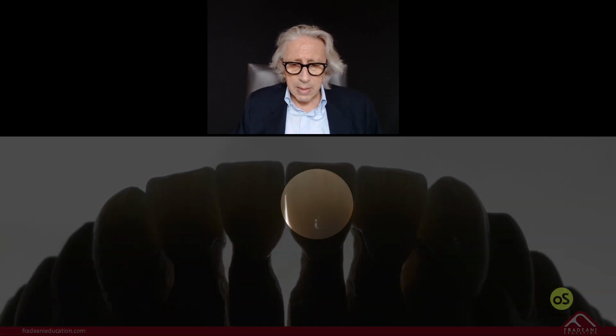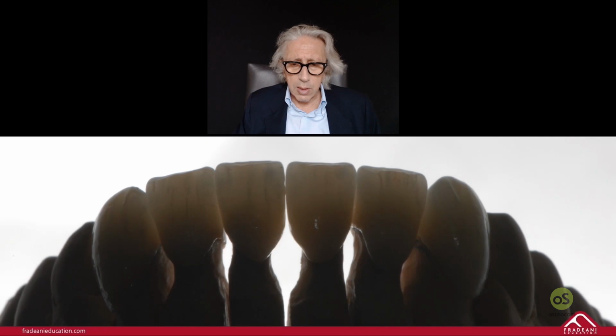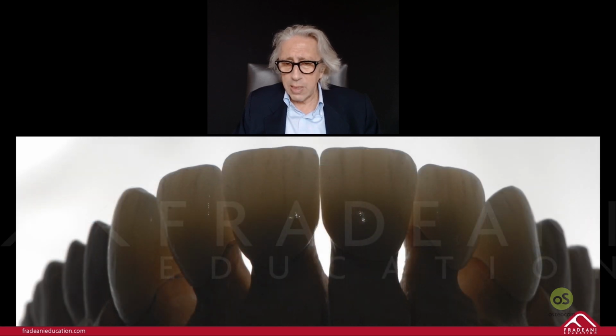All the restorations in place, and you can understand the length is up to here, the length of the abutment, but then you have unsupported porcelain. Look, you can see from the shadow. The cervical part and the middle part is in shadow, and then you have light going through, because the stone abutment doesn't allow the crossing of the light. But the incisal part and the middle part, you see that is half of the tooth that was unsupported, unfortunately. But that was the situation, in the lower and the upper, both.